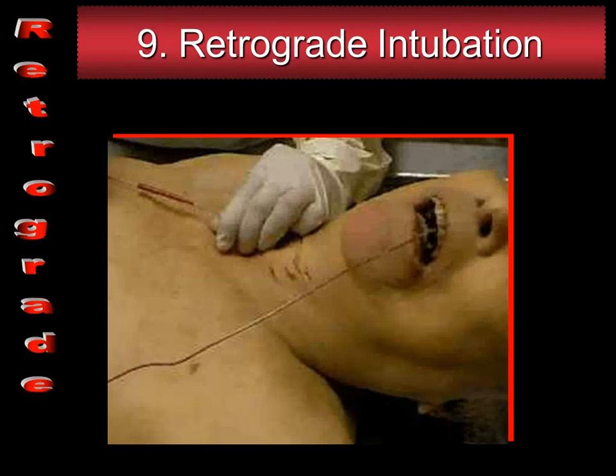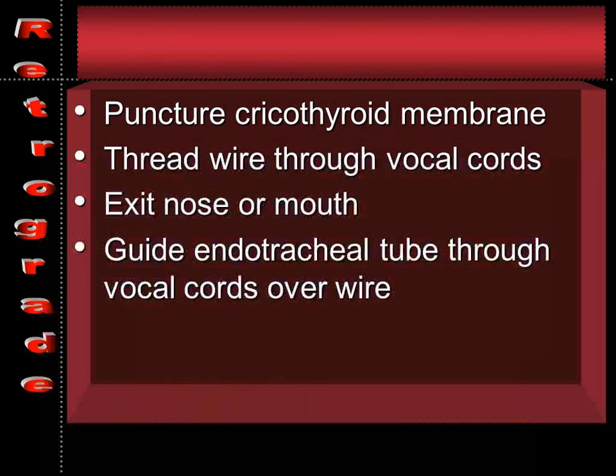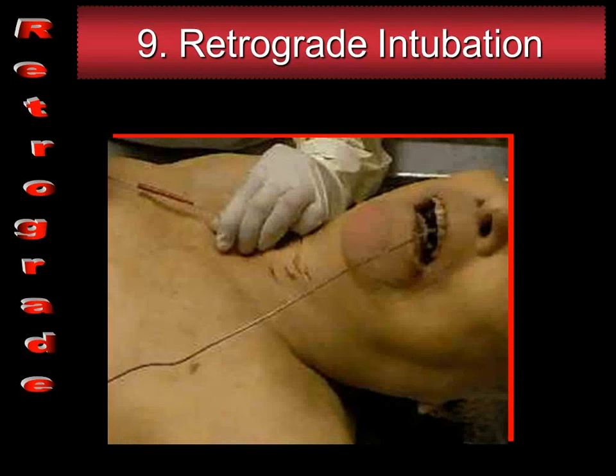All right. So the retrograde intubation, the first step of it is very similar to doing your transjet. So using the needle, this time, instead of pointing towards the person's feet, you point towards their mouth. Same procedure, everything else. 16 gauge Angiocath, I have attached a little bit of water. Push into the membrane, aspirating, get the air, stop, pull the syringe off.